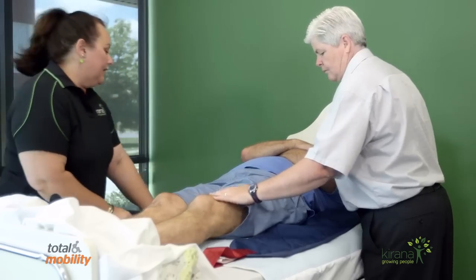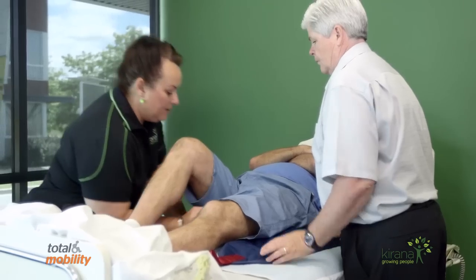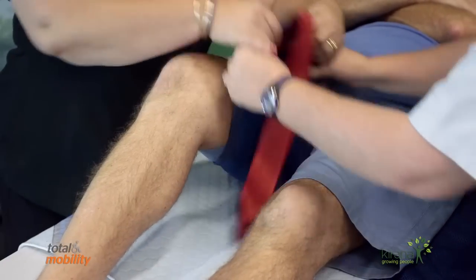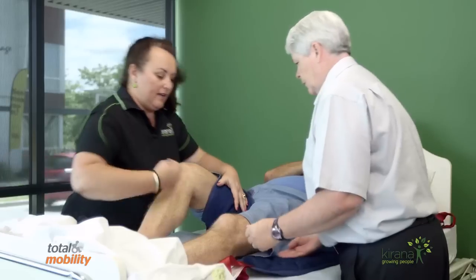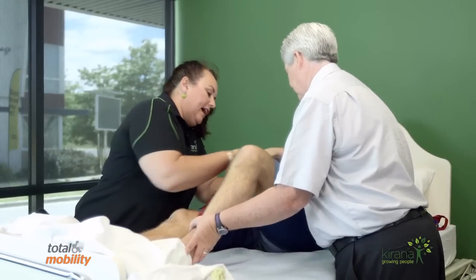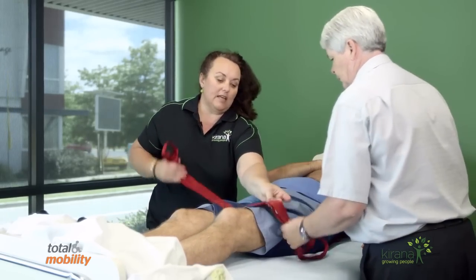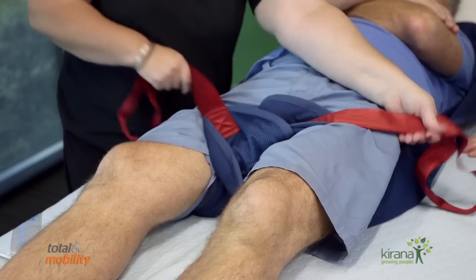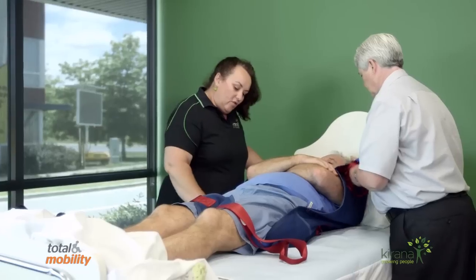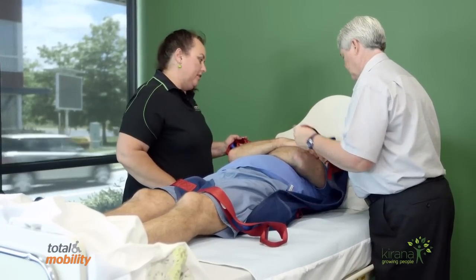So now we need to place the bottom of the sling between your legs. If you can raise this leg slightly for me, I'll bring that in — and this needs to be up and flat on the inside of your thigh. And Angela, we'll do the same — up and flat on the inside of your thigh. Sometimes these leg straps can be crossed over and sometimes they're kept open; we'll be using them open today. So you're now placed in the centre of the sling, and we're now ready to bring the hoist over.